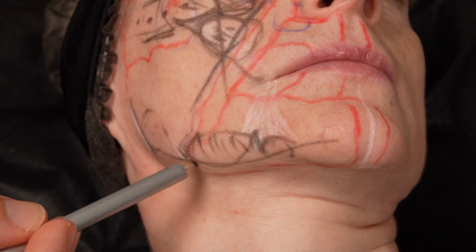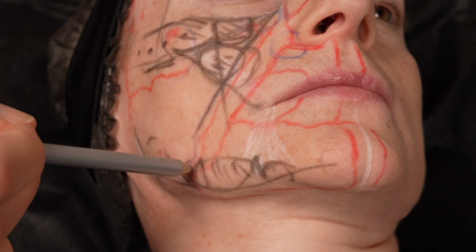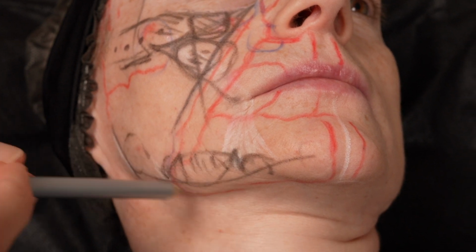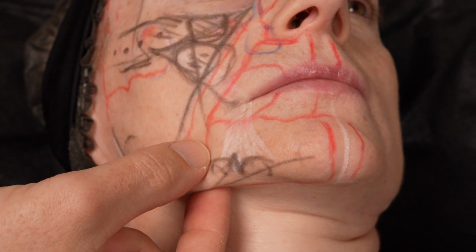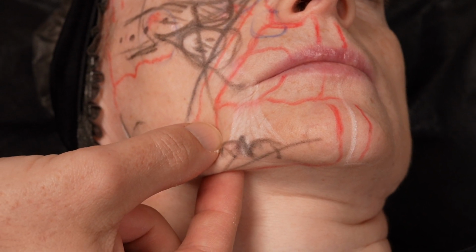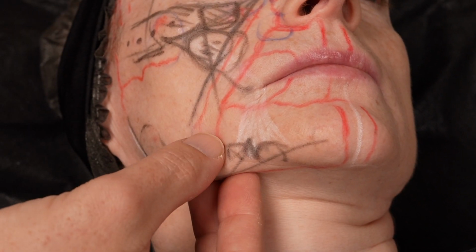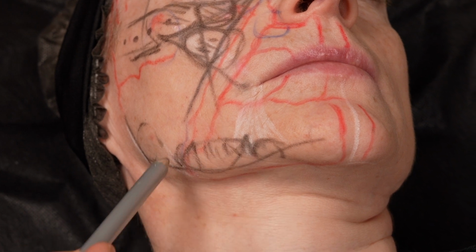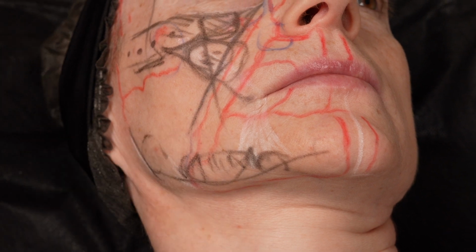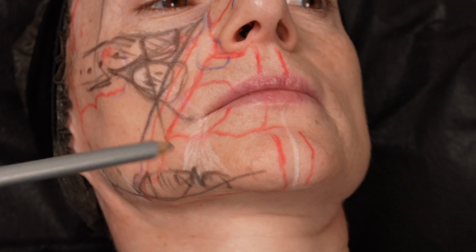The important point is to find the facial artery. You cannot inject here until the mandibular ligament. In jaw sagging, it's also high volume because my aim is to hide it. So I don't need volume here. I need volume more anterior and more posterior. And the second one is that between these 2 points, the artery can be found. So deep injections with needle are forbidden in this area. This is the lower third area.